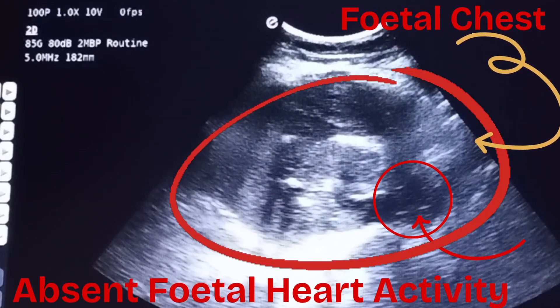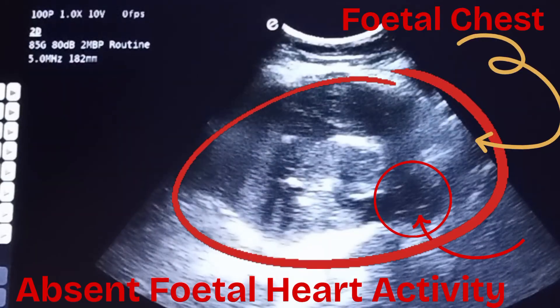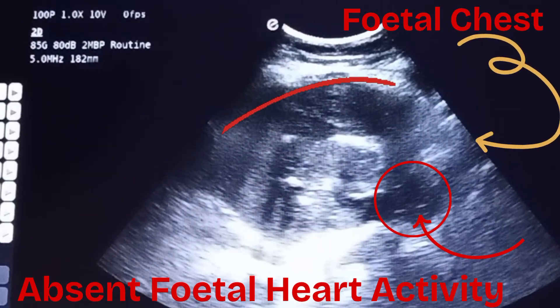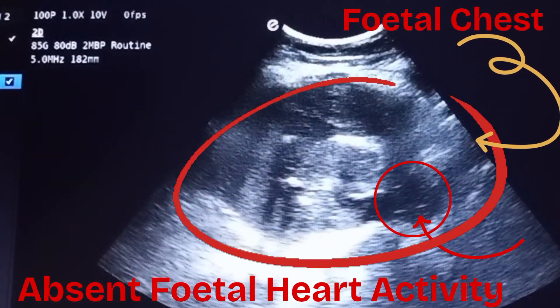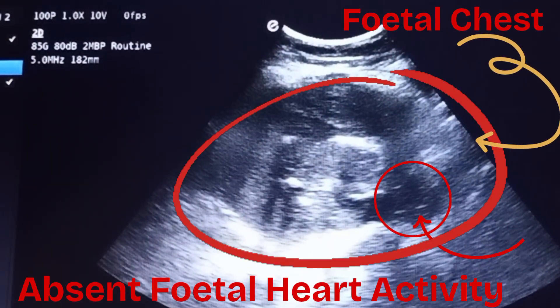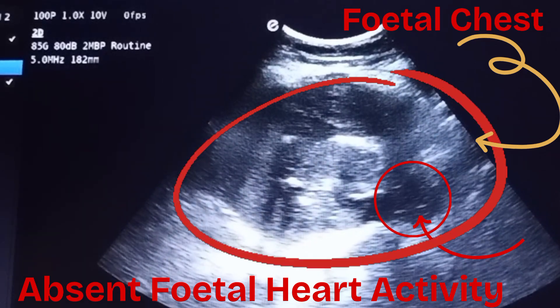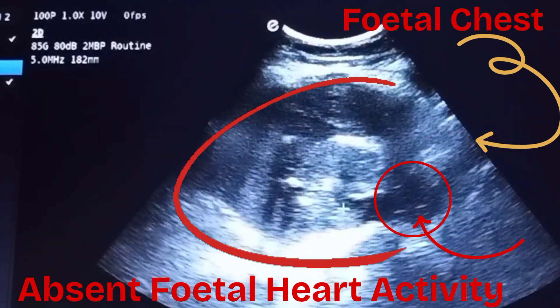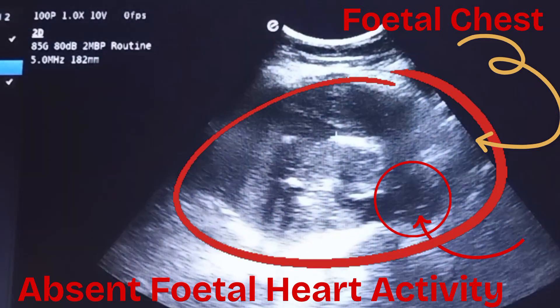Inside the red outline, the fetal chest can be seen, with a yellow arrow indicating it inside the red oval lines. Inside the small red circle, the fetal heart can be seen with a red arrow pointing to it, showing no activity.